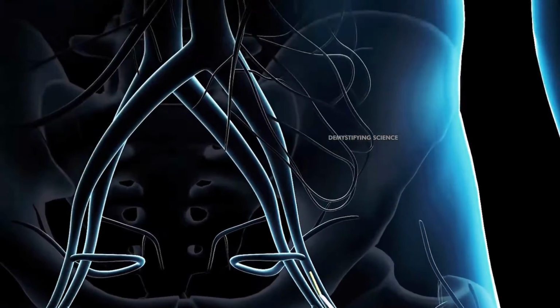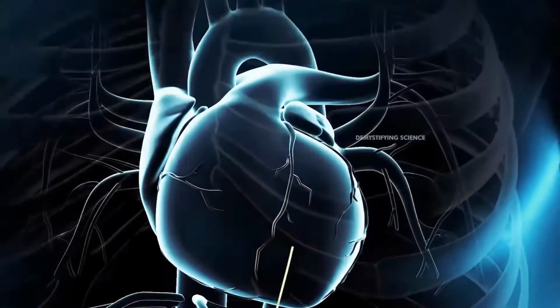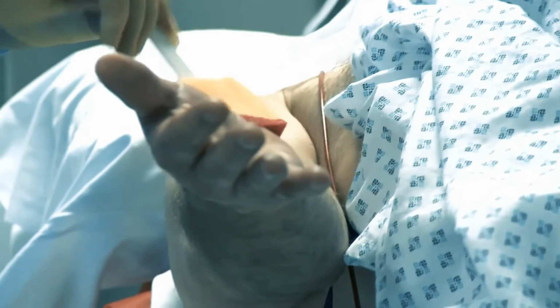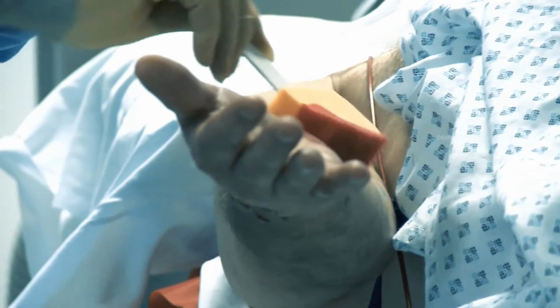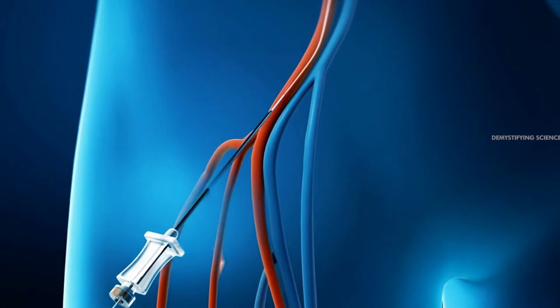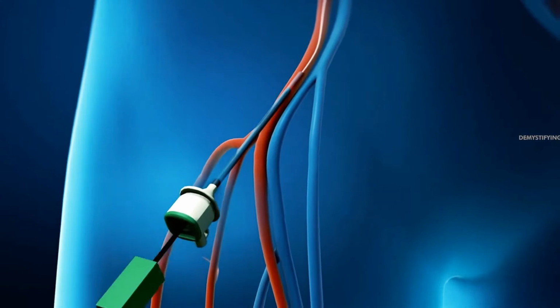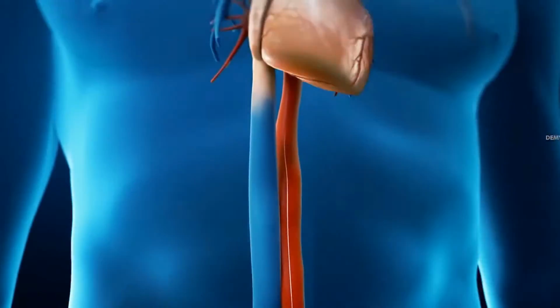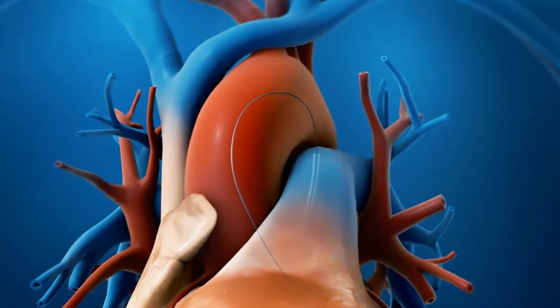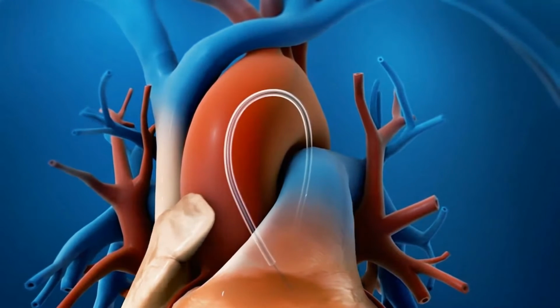Coronary angiography is often done along with cardiac catheterization. An area of your body, the arm or groin, is cleaned and numbed with anesthetic. The cardiologist passes a thin hollow tube called a catheter through an artery. The doctor will use live X-ray pictures to carefully guide the catheter up into your heart and arteries.